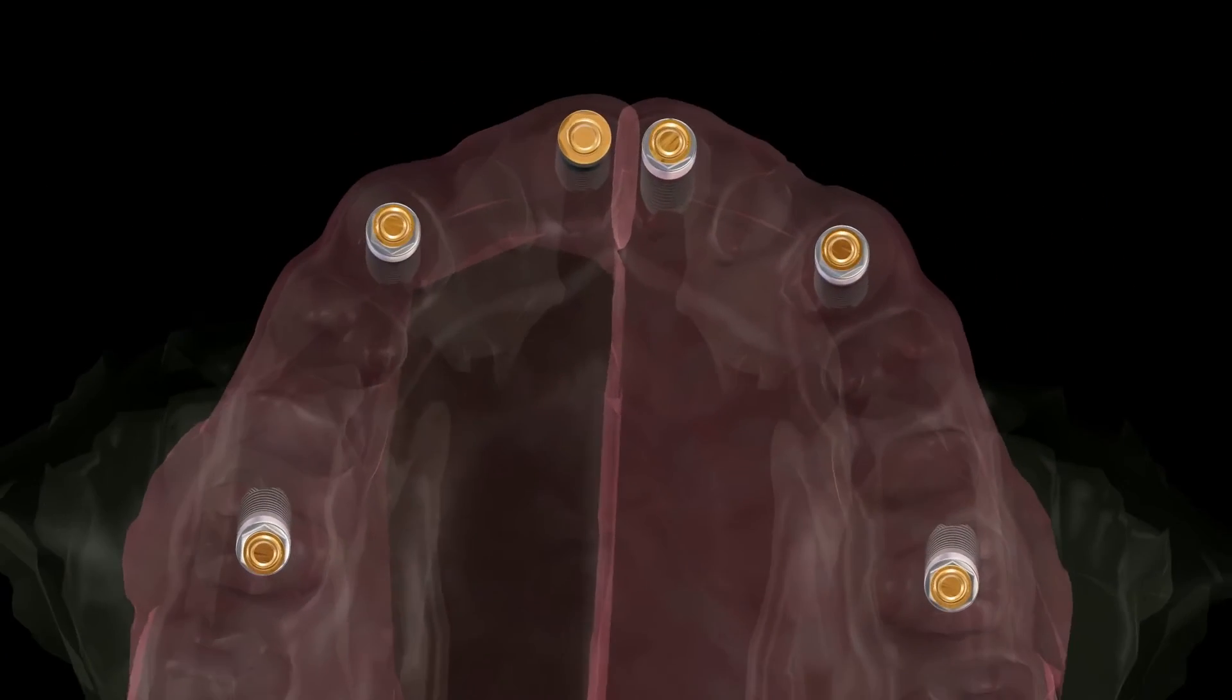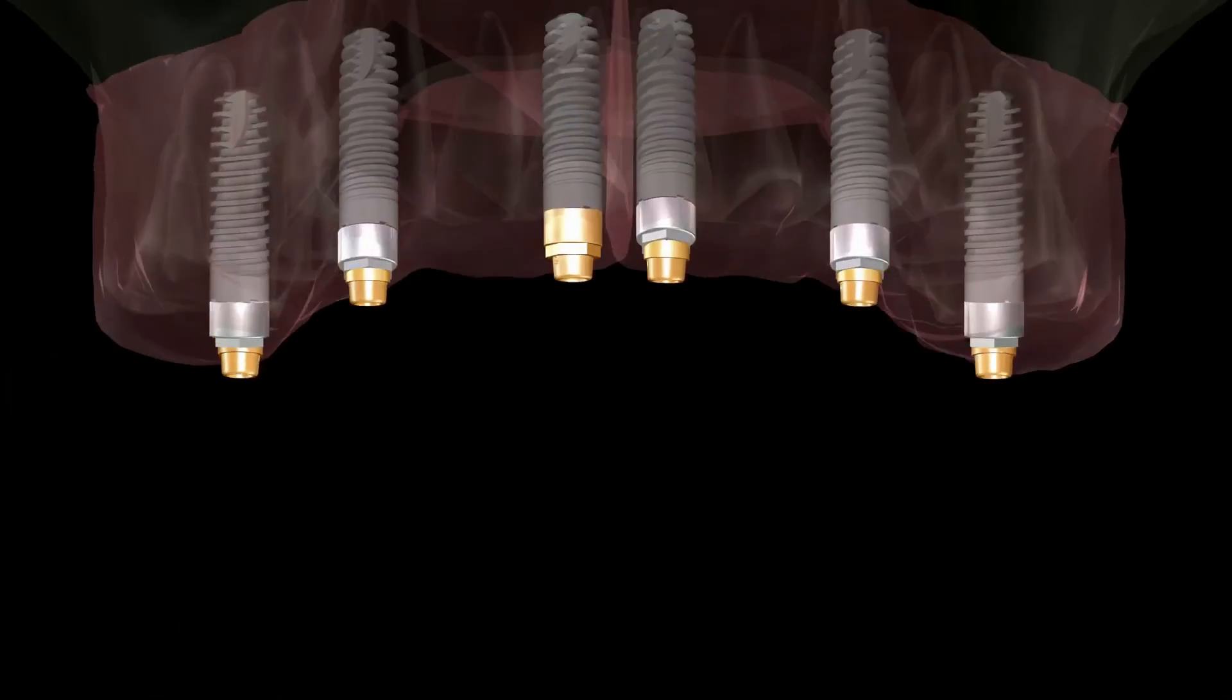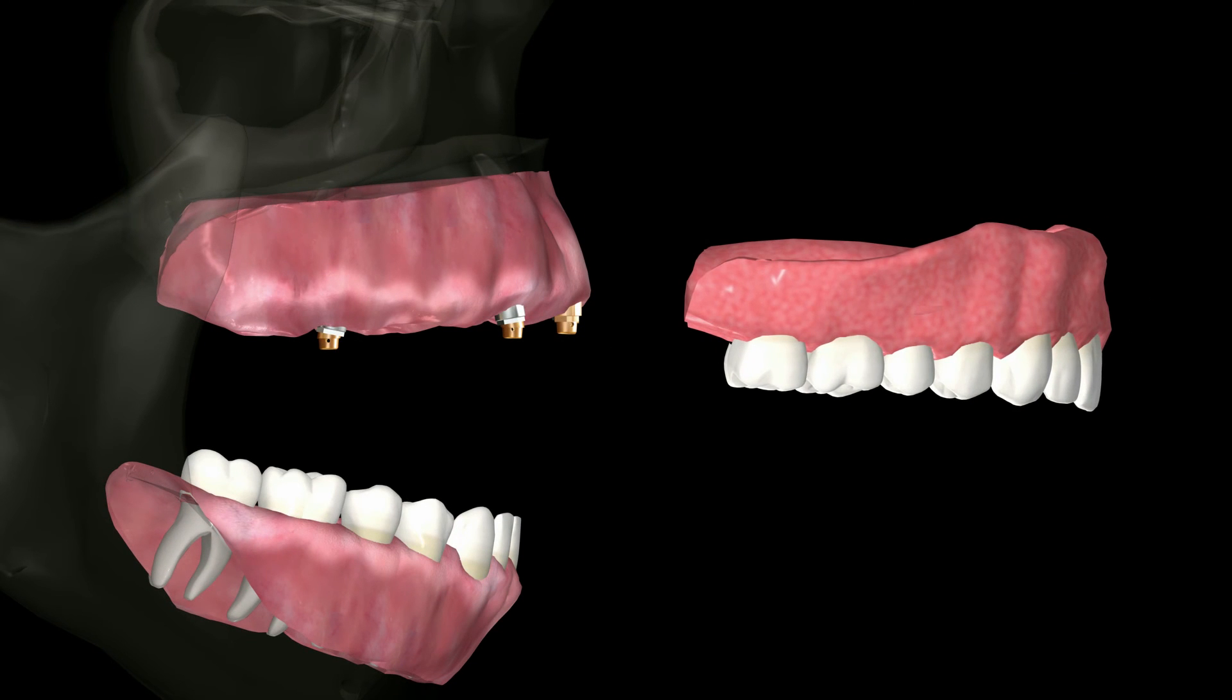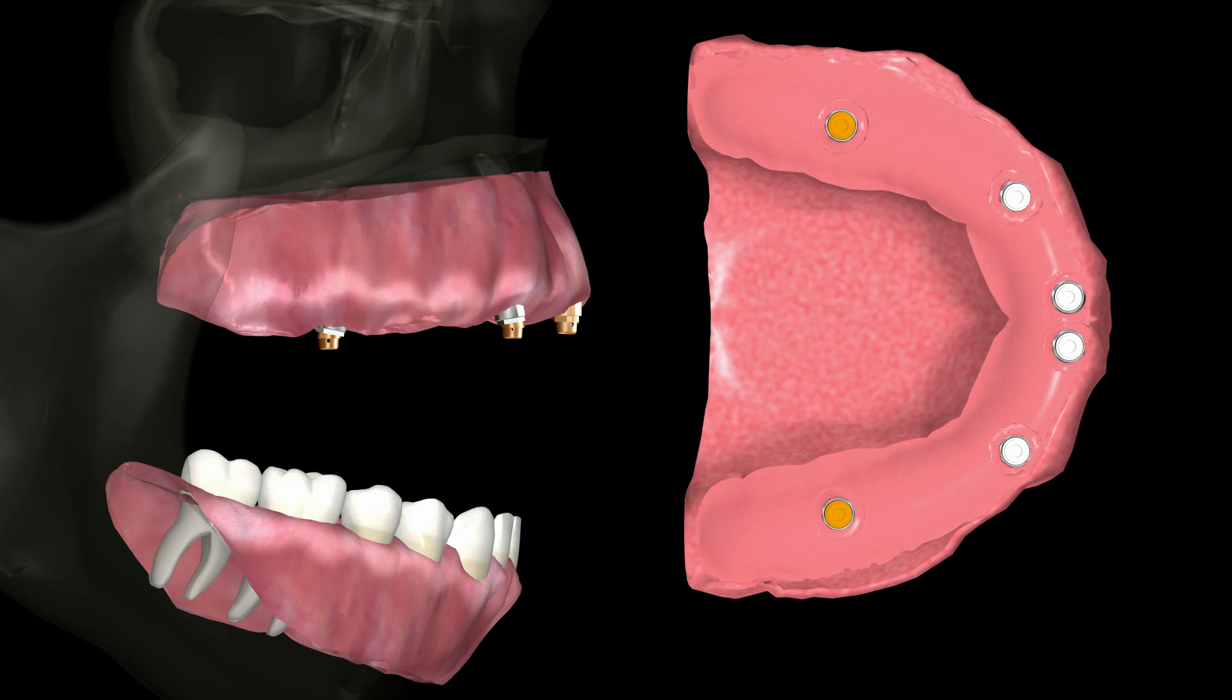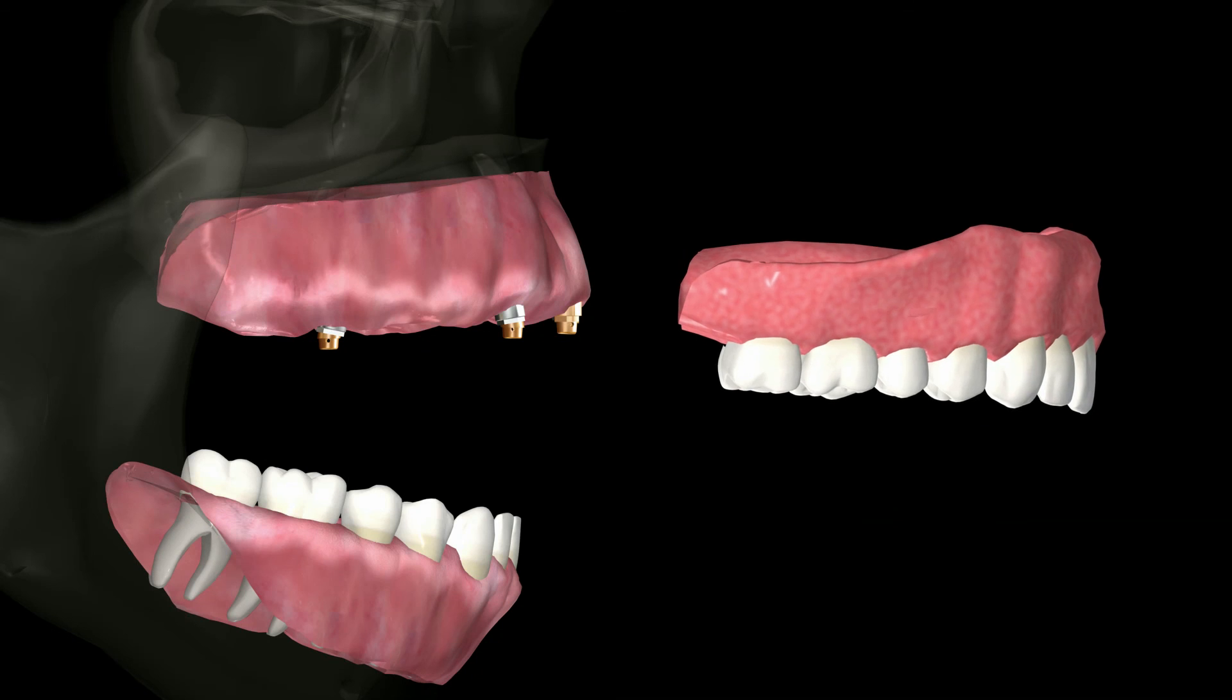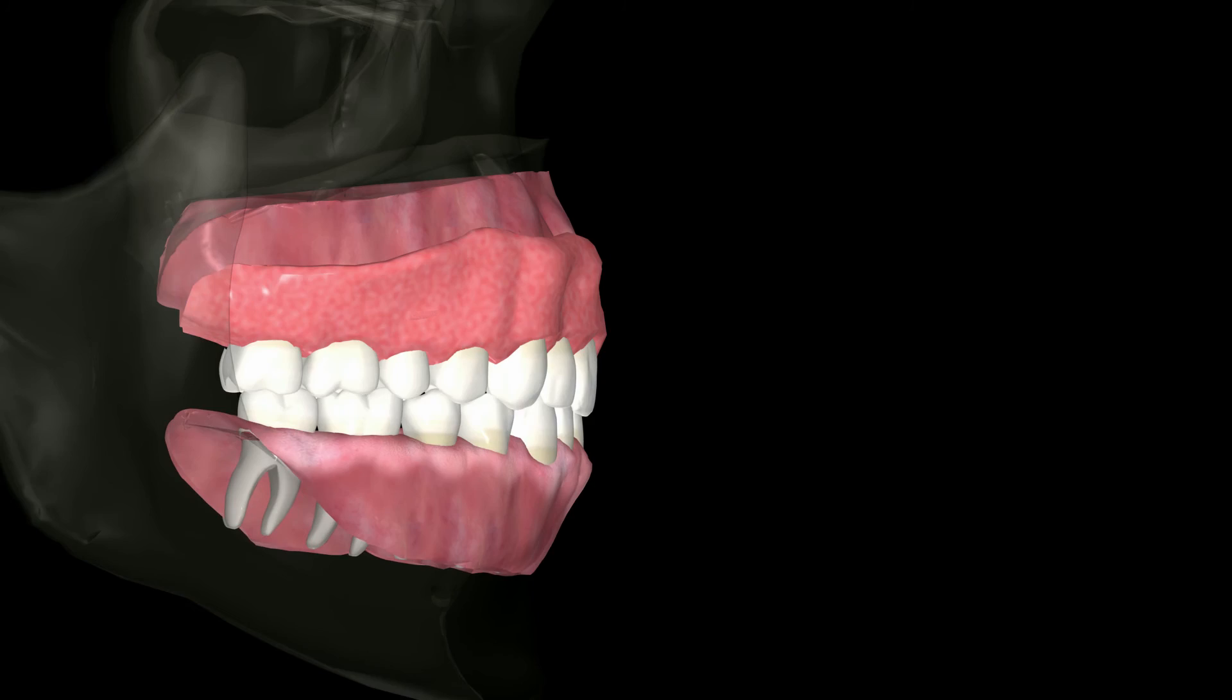After the black ERA males are processed into the denture, they are then replaced with the white or orange nylon inserts. This change from the black processing nylon to the white or orange nylon activates 0.4 millimeters of space between the males and females. This allows true vertical resiliency. Thank you from the Sterngold Company.